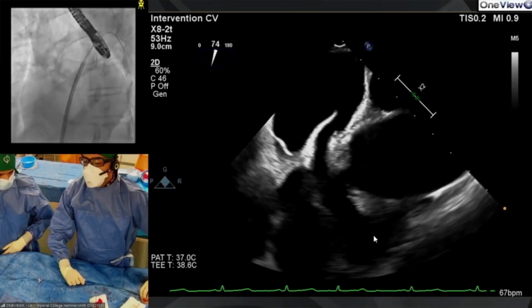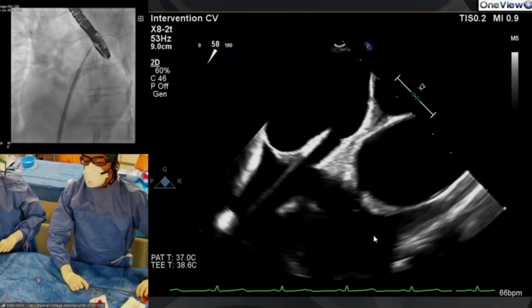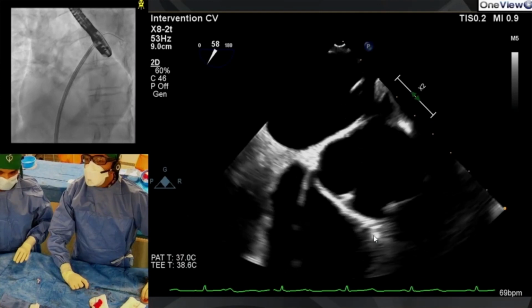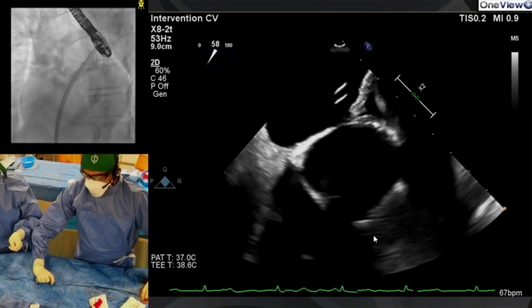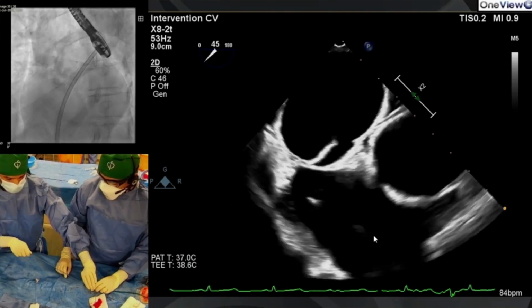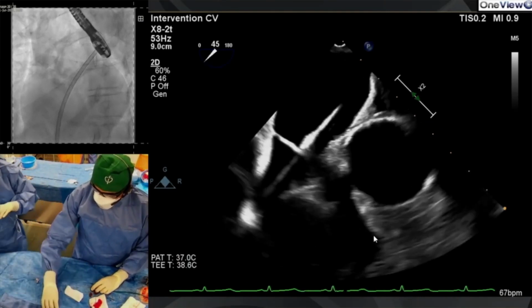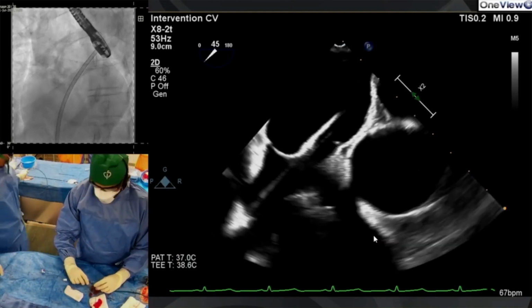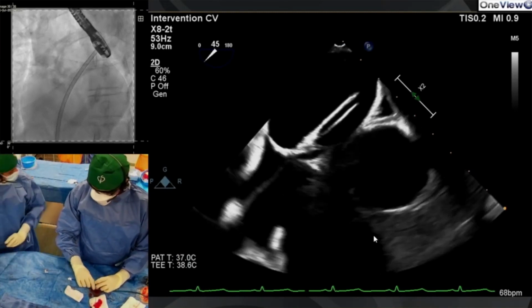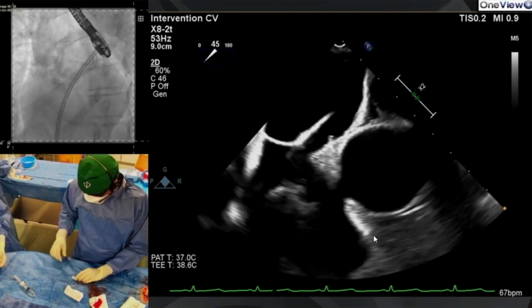What I'm very conscious of is how much radiation Bushra gets. So one thing that we routinely do is, if Bushra sees the tram lines of the sheath, which she's going to show in a minute, then you actually don't need to do any fluoro until all the way up and you see the device inside the tram lines. It might be worth trying to demonstrate that, because I'm very nervous that if we lose Bushra or Nilesh, our programs are pretty well screwed. So we want to keep them alive as long as possible.